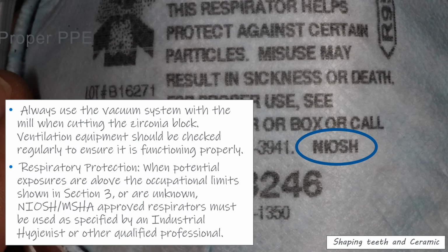As with anything, I want to make sure that you're safe. So make sure that when we are actually adjusting porcelain, whether it is something like lithium disilicate or zirconia, you have proper ventilation, and make sure that you read your MSDS or safety data sheets to understand what type of respiratory controls you need. So I like to wear N95 masks whenever I'm adjusting my zirconia and when I'm adjusting my lithium disilicate.